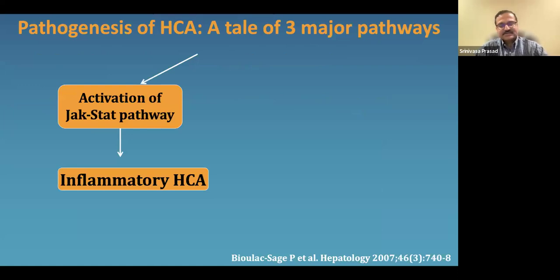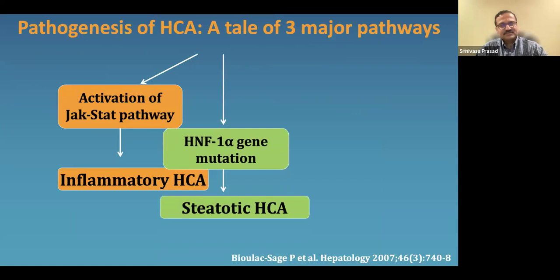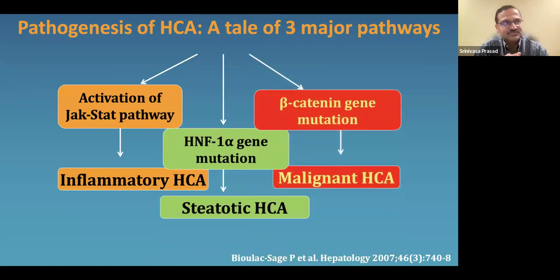The recent changes and advances in genetics and imaging, as well as molecular biology of various tumors, have expanded our understanding of a variety of tumors, including hepatocellular adenomas. Now we know that there are basically two main imaging flavors, the steatotic and the non-steatotic adenomas, that we can distinguish based on imaging characteristics.